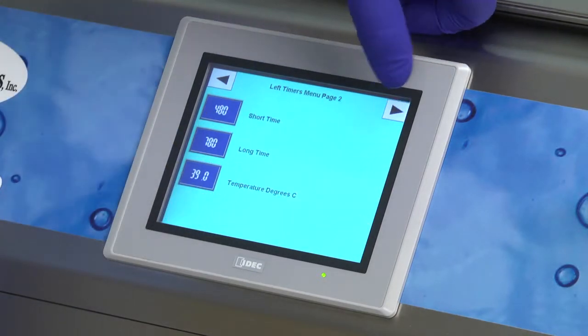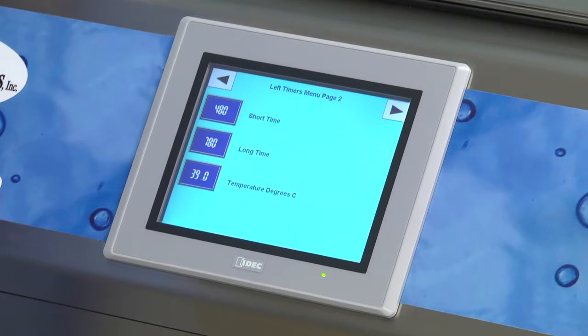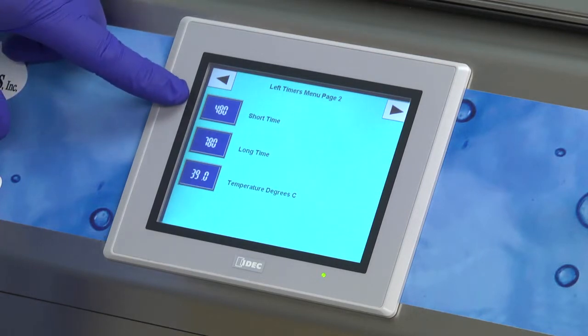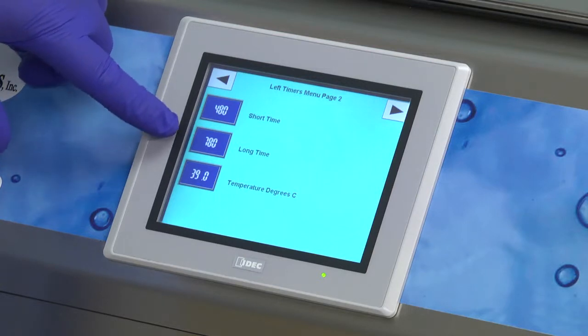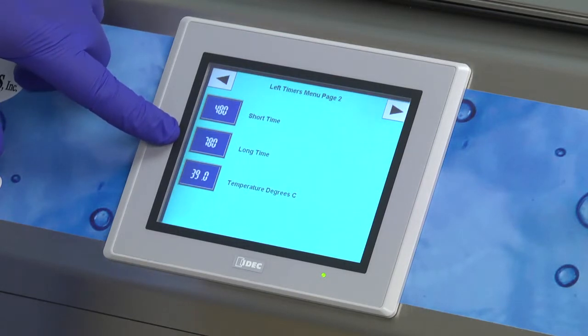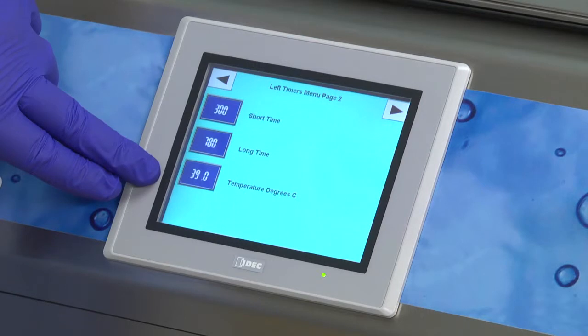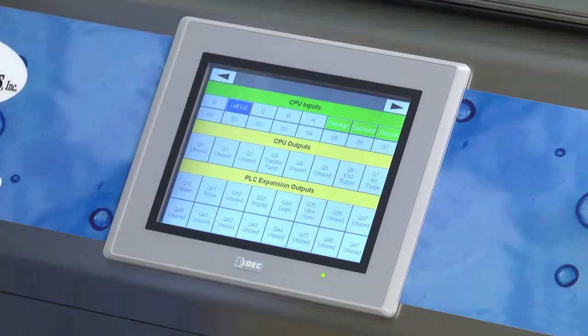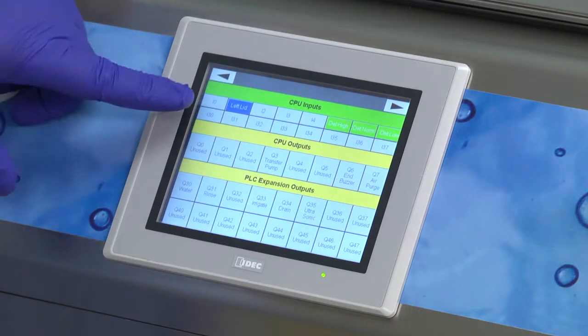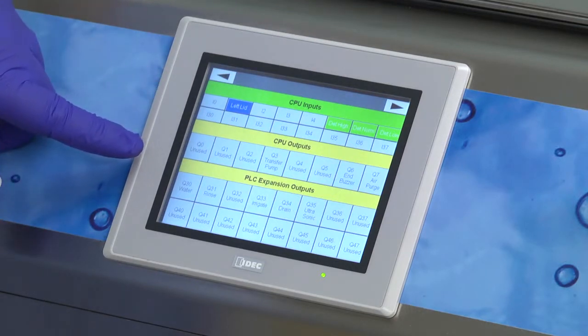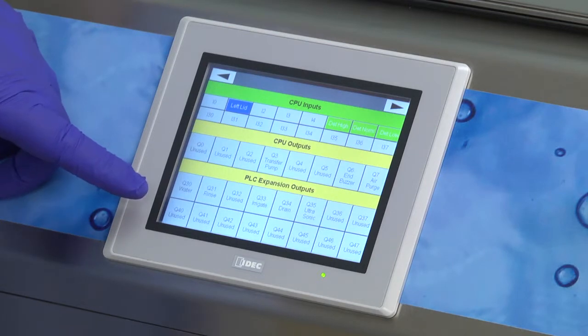Press the top right arrow to advance to page two of the timers menu. The short time is the length of time for short cycles and is preset to 480 seconds or 8 minutes. The long time is the length of time for long cycles and is preset to 780 seconds or 13 minutes. Temperature is the basin water temperature setting and should never be changed. Pressing the top right arrow again advances you to the input-output menu. This screen is used by technicians to test the various functions and components in your machine. This menu should only be used by qualified technicians.